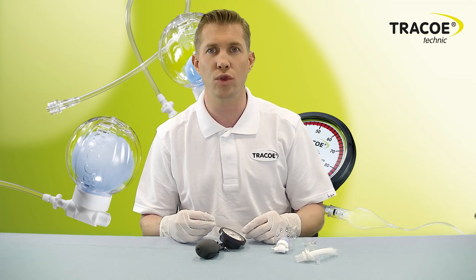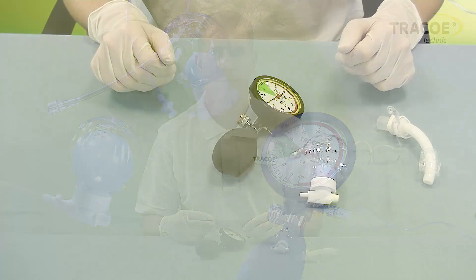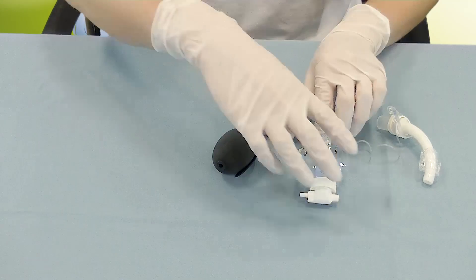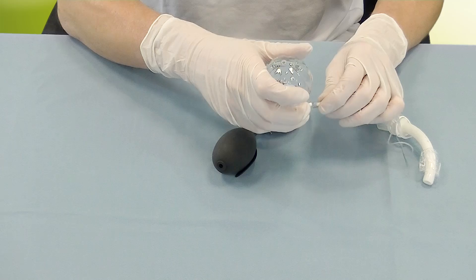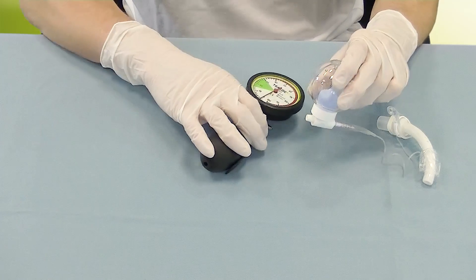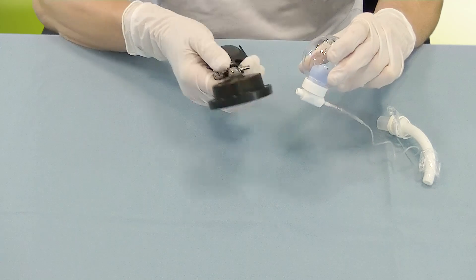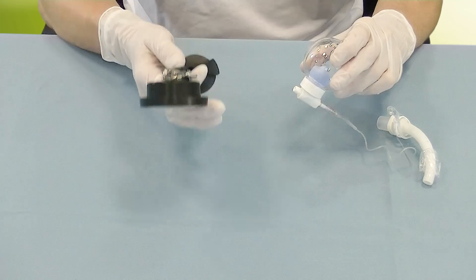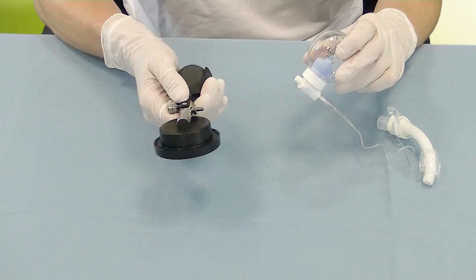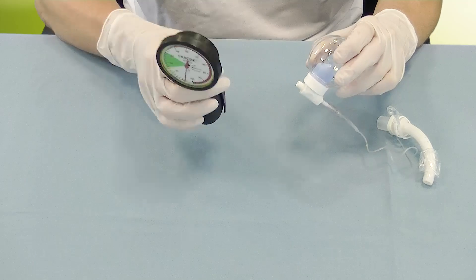The use of the TracoSmart Cuff Manager happens in two simple steps. First, the TracoSmart Cuff Manager is directly connected to the tracheostomy tube or endotracheal tube. Secondly, the TracoSmart Cuff Manager is inflated by means of either a syringe or cuff pressure monitor.